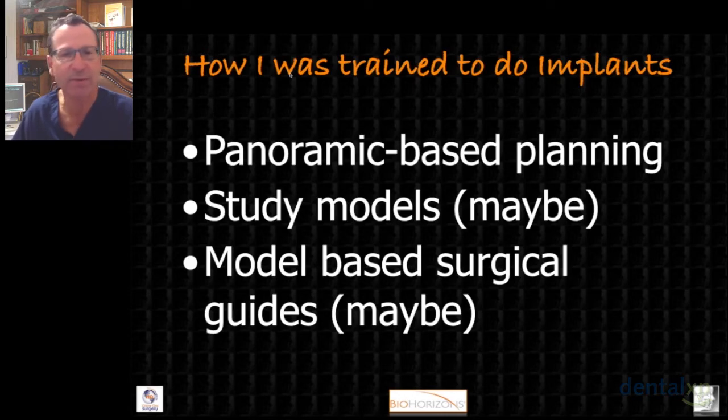And then of course we determined the width of the implant essentially by the size of the tooth, a wide platform generally for a molar, a narrow diameter for usually a lower incisor or an upper lateral incisor, and then somewhere in the middle for premolar teeth and canines.